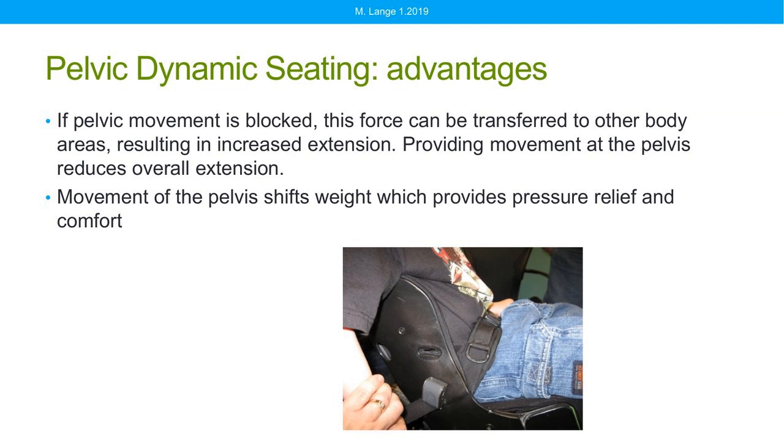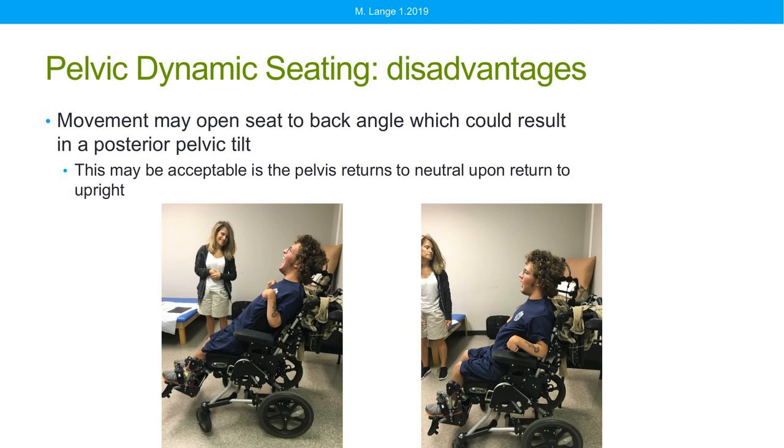Also, by allowing some movement at the hips, we're providing some weight shifts. Now, we're not offloading areas completely, but we are providing some change in position, and that can also help with pressure relief and comfort.